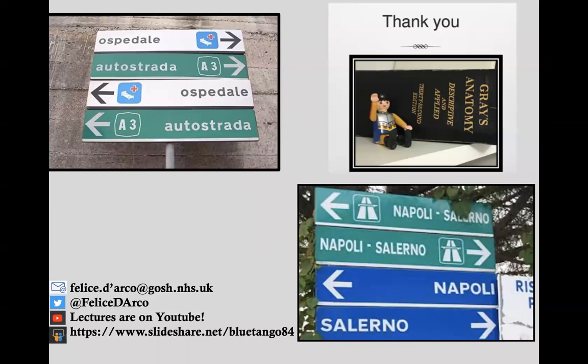So I wanted just to show you these few cases because they are very, very nice and can allow you to do diagnosis. It's just an introductory lecture to give you a hint of what we are studying, what is very, very nice for us to know as radiologists, so this syndromic association.